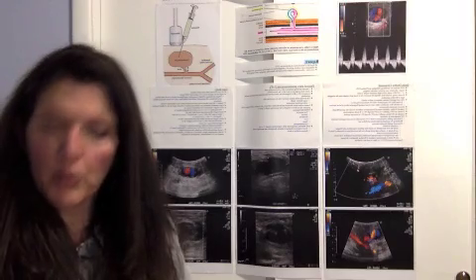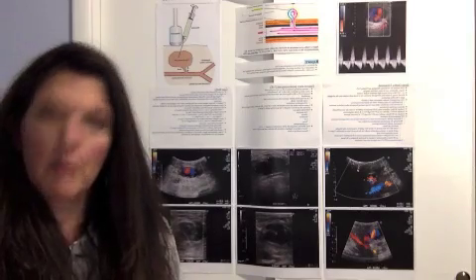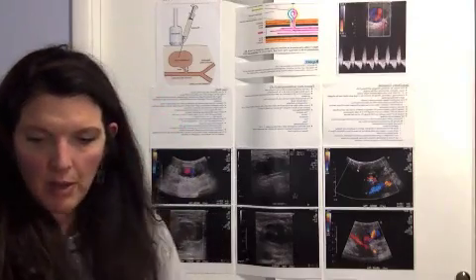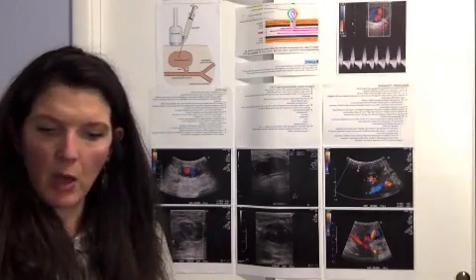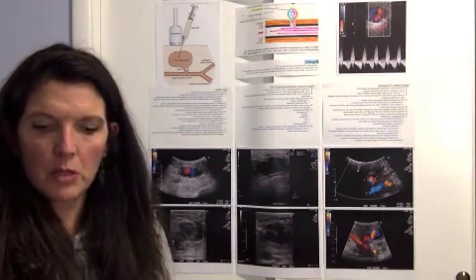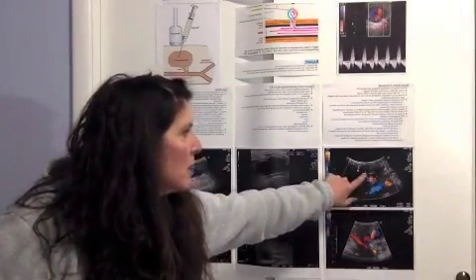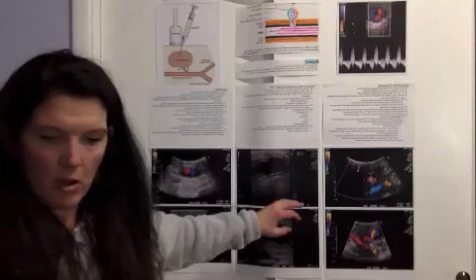On completion of this procedure, the surgeon noted a hematoma at the site of the catheter insertion and ordered a groin Doppler ultrasound exam, which took place 3 hours status post. In this exam, we found a 1.5 centimeter by almost 2 centimeter pseudoaneurysm, and this is the picture of it. This is the adjacent artery, and then basically they decided to keep an eye on it.